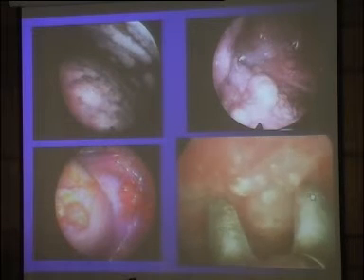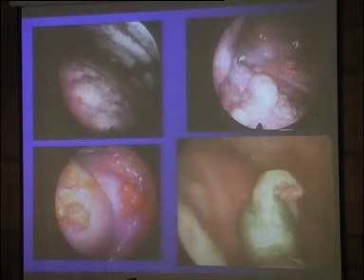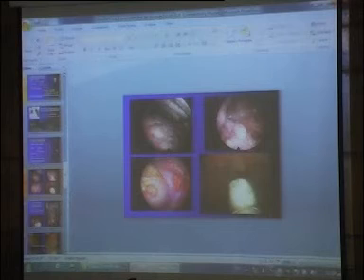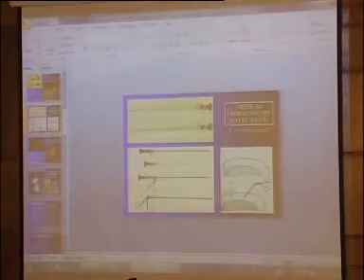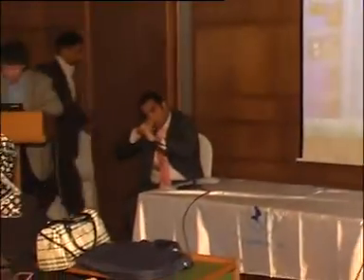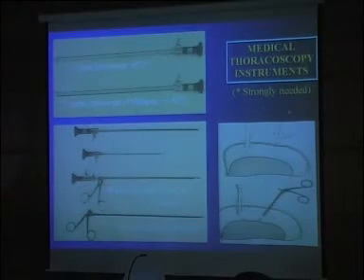With trocar and telescope, or with one biopsy and we enter the channel through it, like the fiber optic. No, the biopsy forceps is just an instrument, but you already have the trocar, and you're using this forceps, okay? You're putting it through the trocar and seeing what you're taking. You put this trocar here, okay? And through this trocar you put this forceps, okay? Am I clear? You understand?